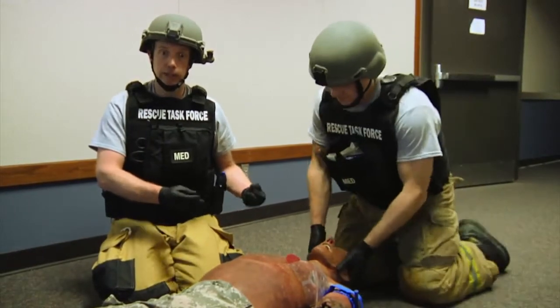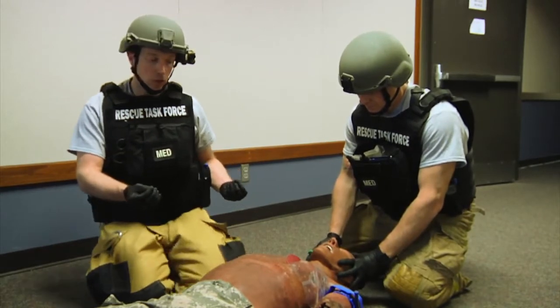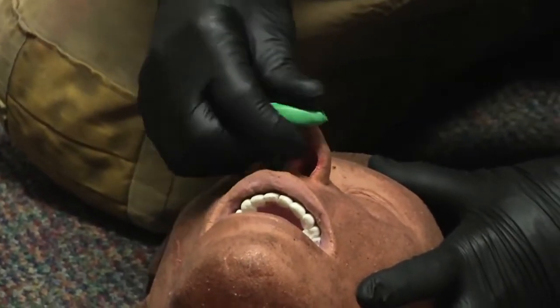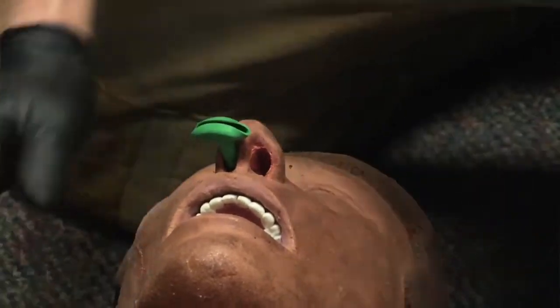Now that we've restored that integrity to the chest wall, we want to move on to managing this patient's airway so that we can leave him and go treat other victims if we would need to, or evacuate him from the area. Mark's going to do that by simply placing a nasopharyngeal airway into the right nare, as he has here. And now we can roll this patient onto his side.